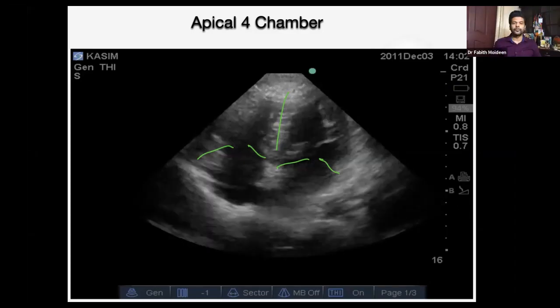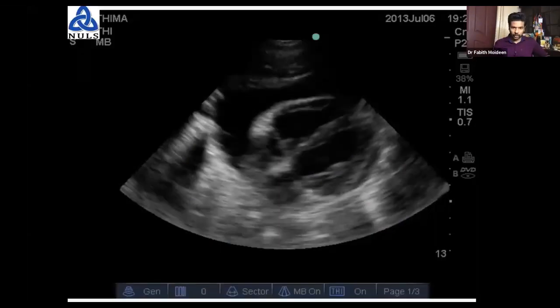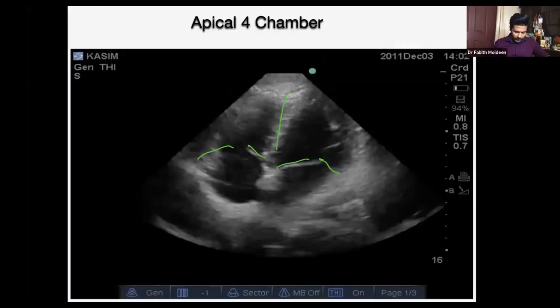All right. Okay, so eyeballing. I forgot to tell you other walls. I hope you remember, you know this. This is a 4-chamber view. This is the LV. I'm sorry, I didn't tell you about that. So that's the orientation. Your pointer was toward the left shoulder, and then you turn the pointer toward the apex. Okay, sorry, toward the left side.